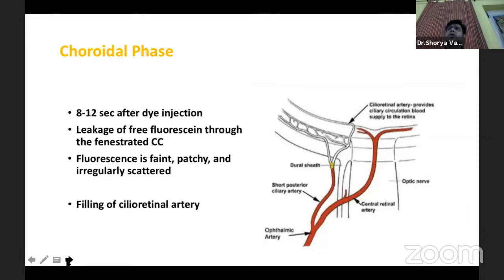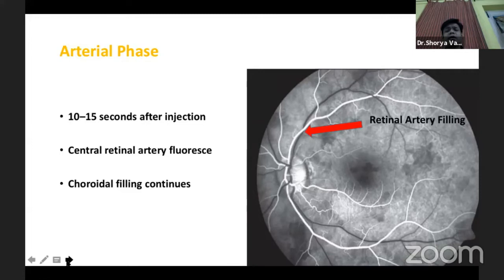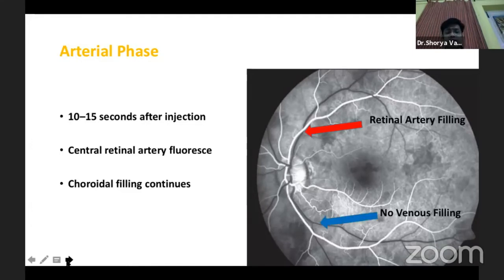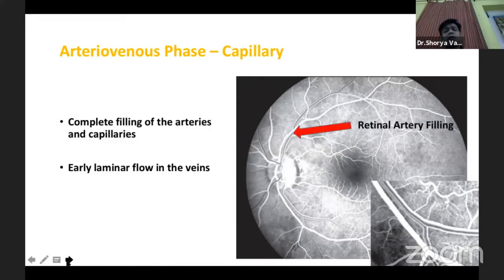If we need to see the cilioretinal artery, we need to check in this choroidal phase since it gets its supply from the choroidal vessels. Then we go on to the arterial phase, which happens around 10 to 15 seconds after injection, where you can see the filling of the retinal arteries but no filling of the retinal veins. Then we go on to the arteriovenous phase, also called the capillary phase, where the dye traverses from the retinal artery to the capillary bed, arterial filling is almost complete, and there is laminar flow in the retinal veins.